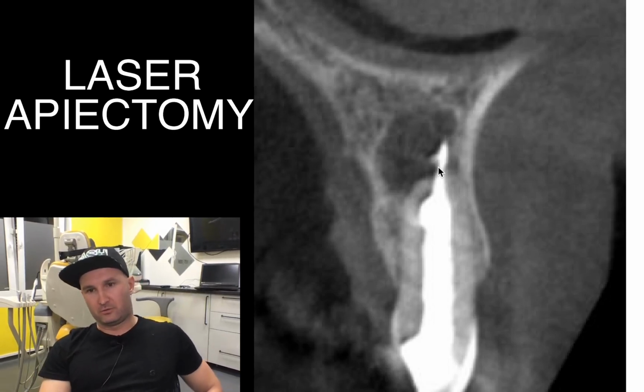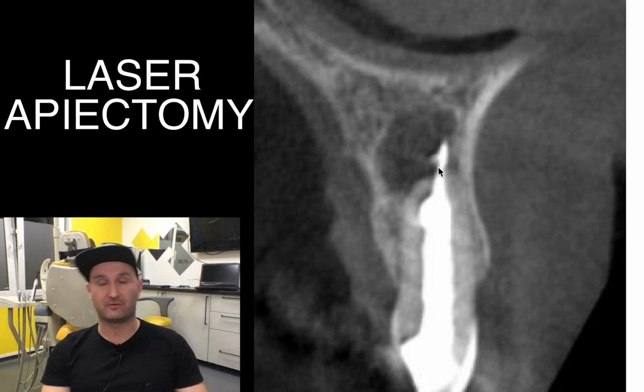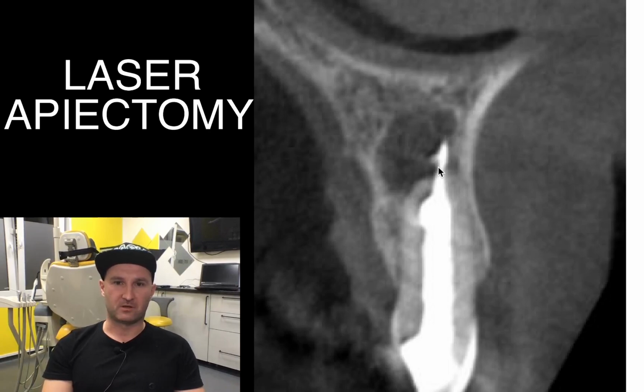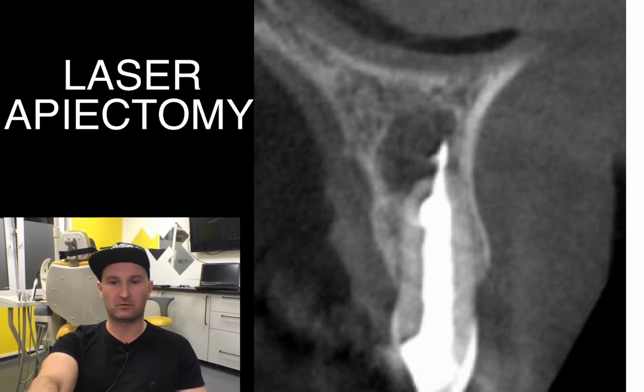Patient agreed to our proposition. We had to consult it with her doctor of medicine, because she had some problems, general problems with health. So her doctor didn't see any problems, and we could proceed with treatment.